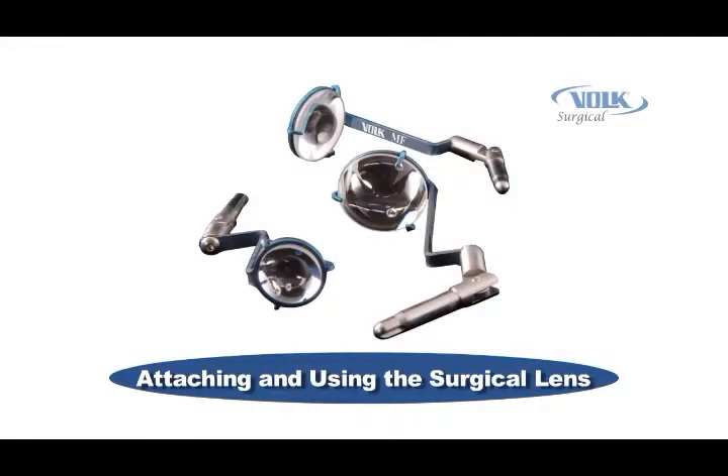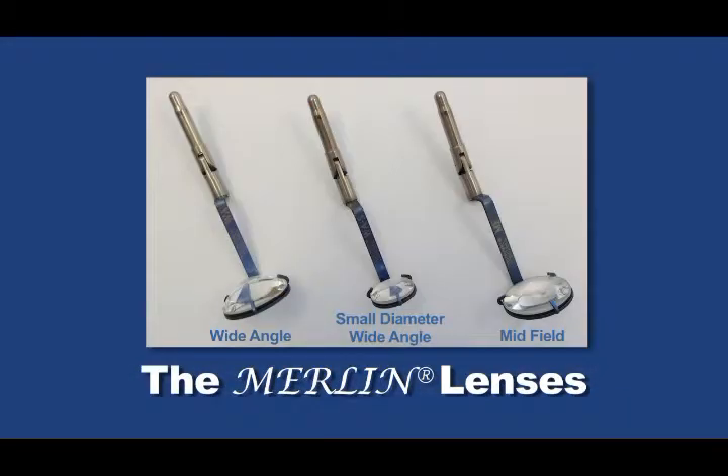Similar to LPUs, regardless of whether you have an automated or a manual Merlin CLA, you will use a surgical lens as part of your system. There are three lens designs for the Merlin Surgical System. While each lens provides amazingly crisp and detailed images, each design provides unique benefits for outstanding flexibility when viewing the retina.